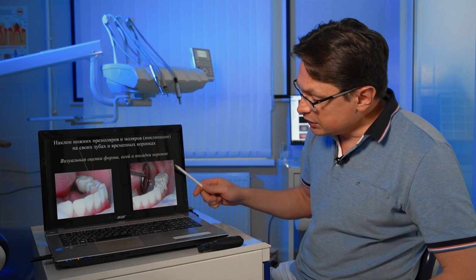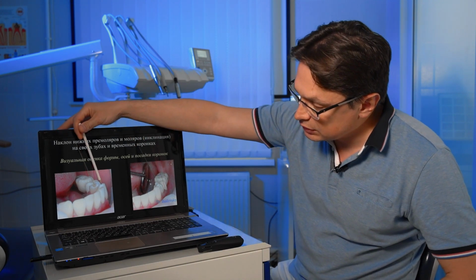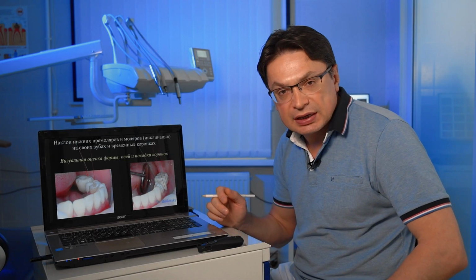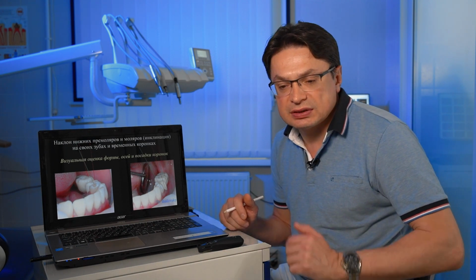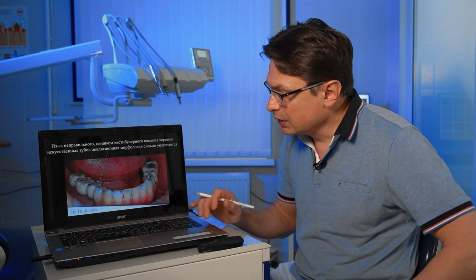Pay attention, on the lower jaw it's the same thing. The patient's teeth have oral inclination, and the technician's crowns, for some magical reasons, are made straight. Therefore, once again, colleagues, even if you have the best technician, nowadays the guys work very well. The level has grown increasingly over the past 10 years. They are really good ones. But all the same, control and responsibility to the patient is everything, and it is assigned to you.